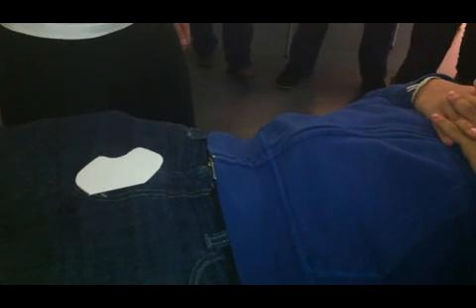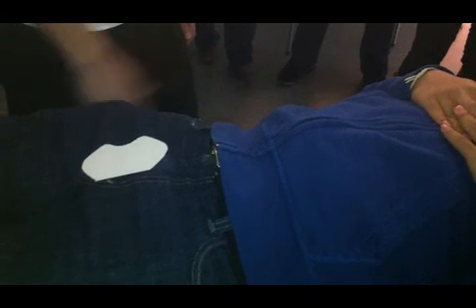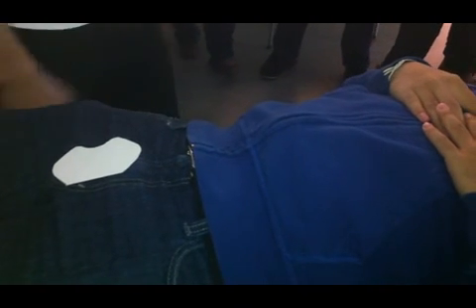I'd see the pictures and wonder, what is that thing on there? It's a shield. How do I get that on there without it being in the way? A little trial and error. Look at the anatomy on a female versus male pelvis, and then you can figure it out. I had no problem finding the symphysis, so it should be easy to get in the right place.